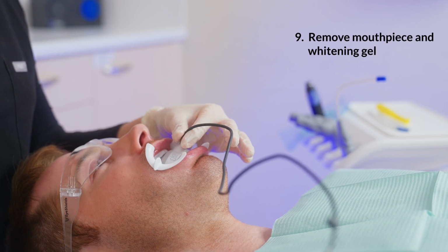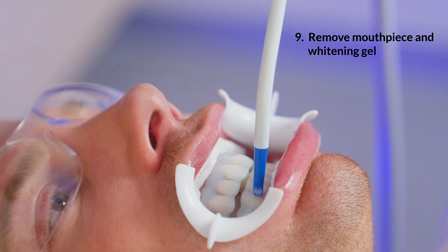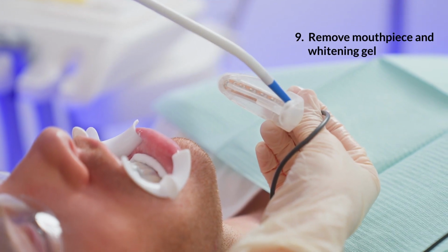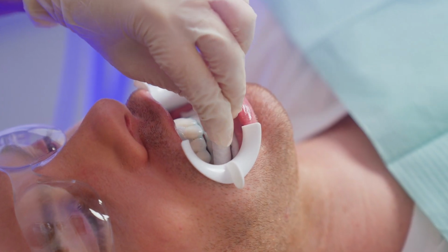Step 9. Remove the mouthpiece and use a surgical suction to remove the whitening gel from the teeth and the mouthpiece. Ensure the gingival barrier is still intact. With a cotton roll, wipe the facial tooth surface and the mouthpiece to remove any residual gel before reapplying.